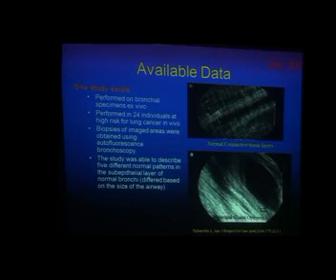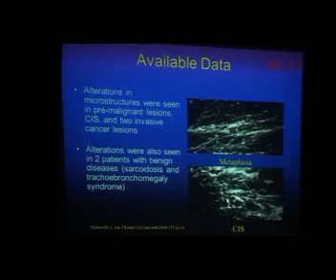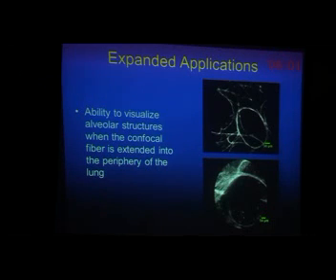And it gives you this, so this is a normal tissue. This is a normal opening of the gland, the mucous goblet glands, the mucous glands. This is the metaplasia which can happen before the early cancer development. That's the cancer inside. So you have to know the picture to differentiate between the normal and abnormal.